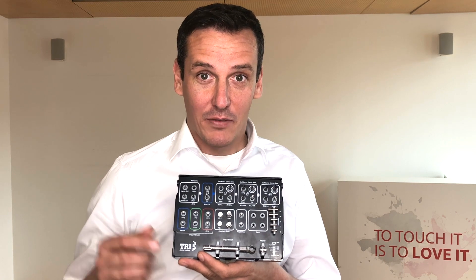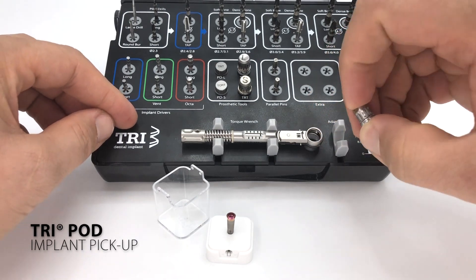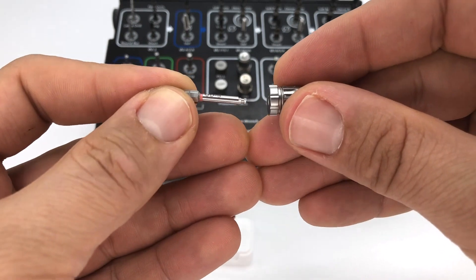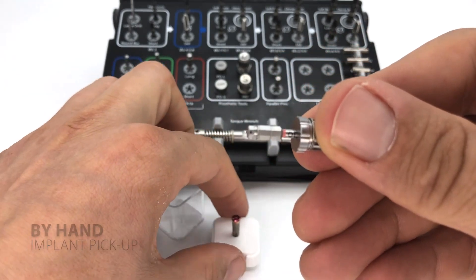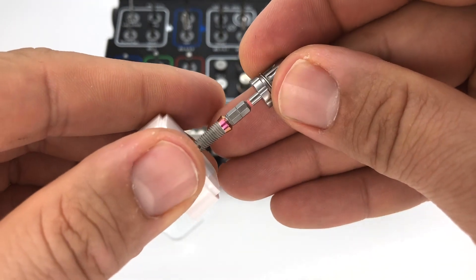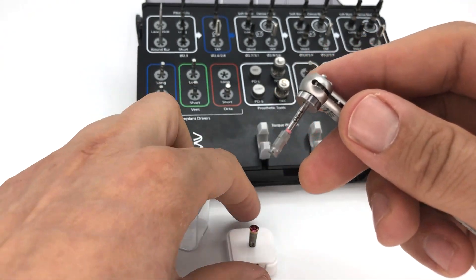With the implant driver from our lean surgical kit, you have three options to pick up the implant from the tripod. First, by hand: take the adapter and the implant driver, put them together, and you are ready to pick up the implant by hand.